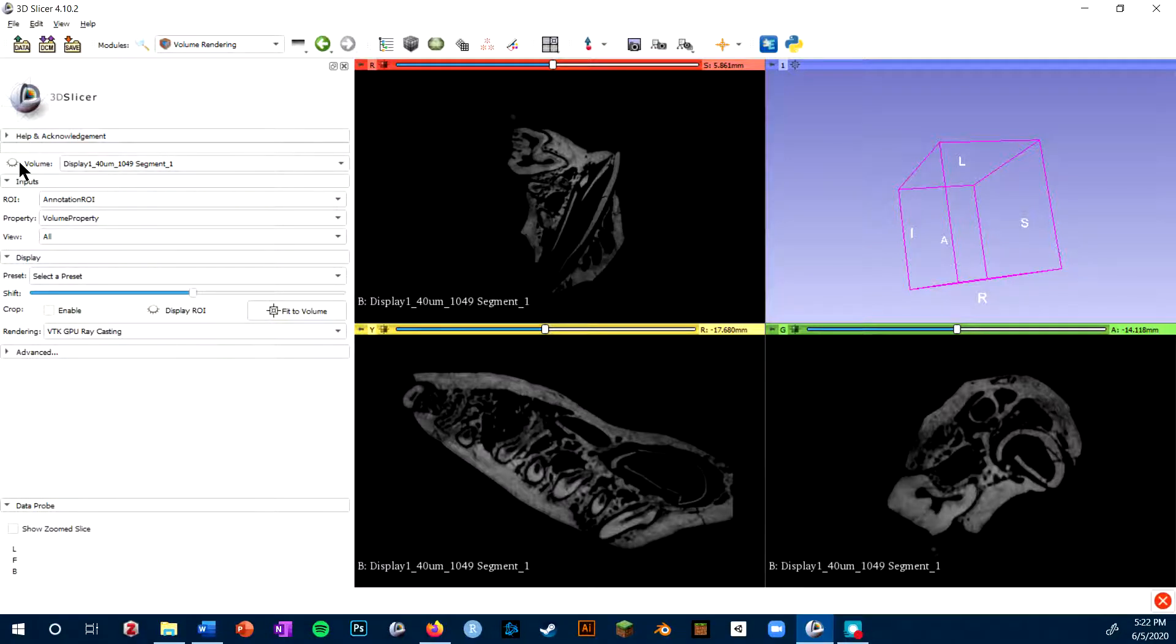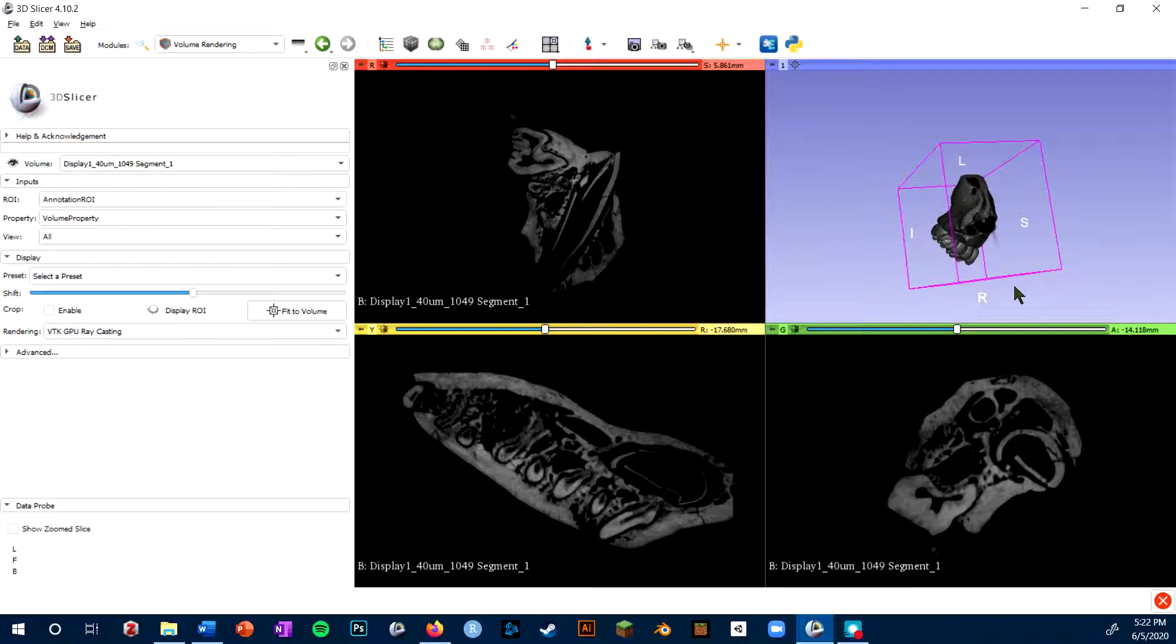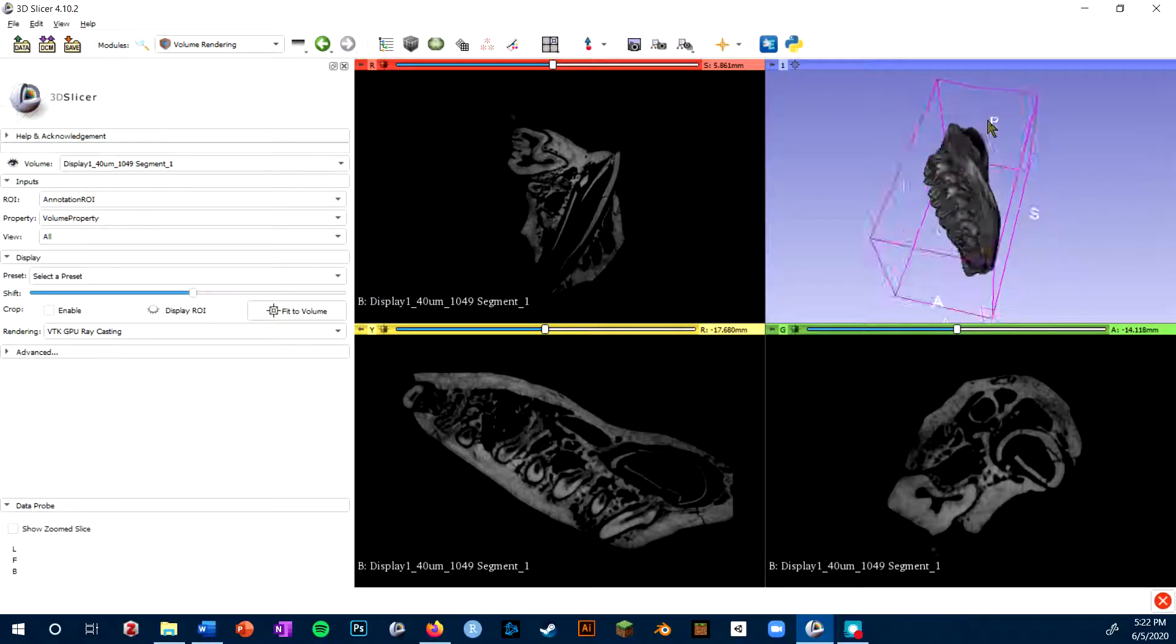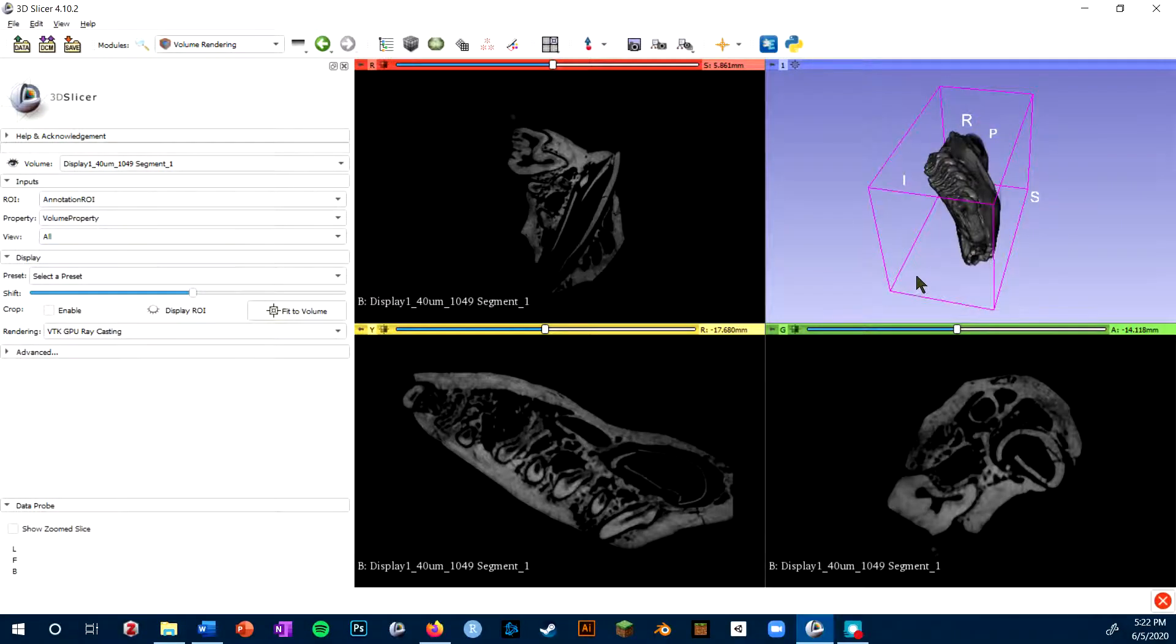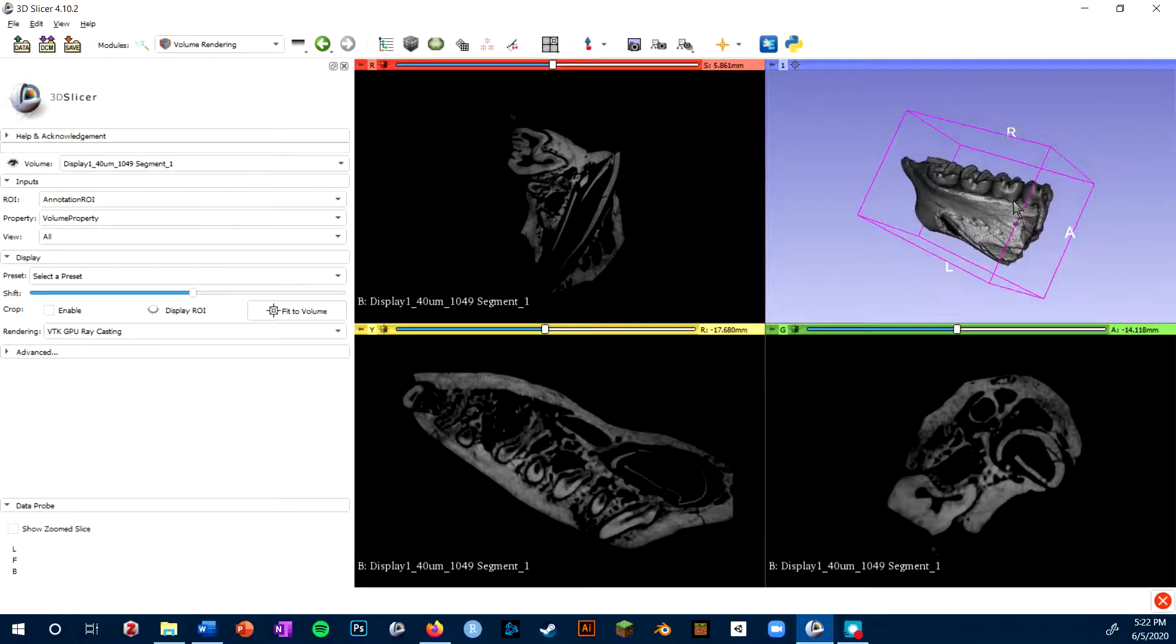Next, you will just click the eyeball next to the volume. That will make your volume appear in this 3D viewport.